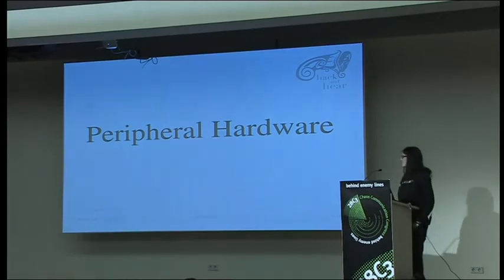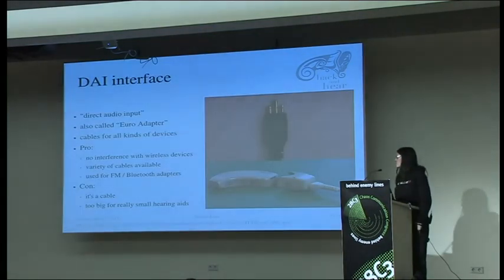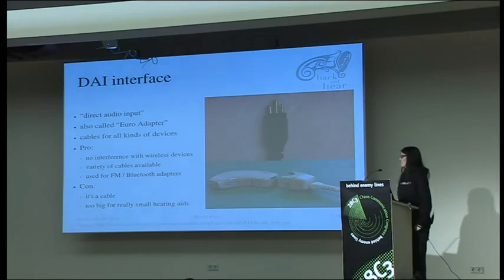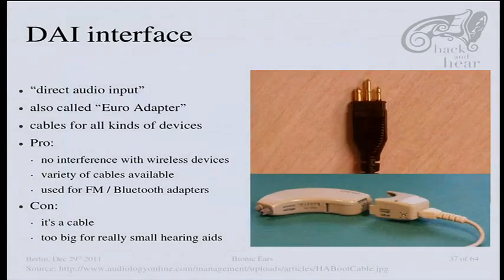Those were the important features of hearing aids, but there is some peripheral hardware that I would like to present. So there are different interfaces which you can use to plug into your hearing aids. The oldest one is the direct audio input, which is just a cable.